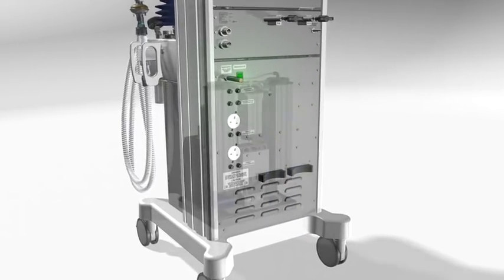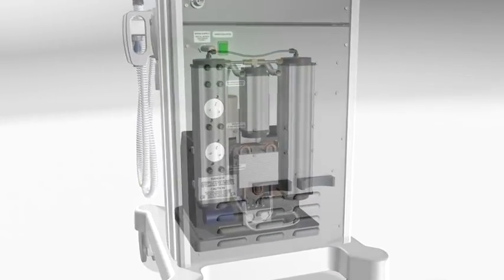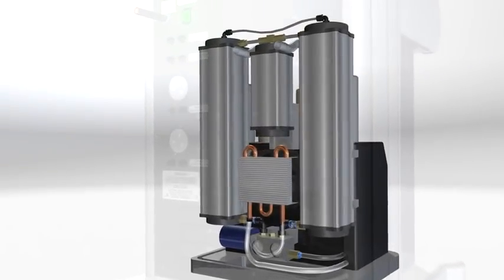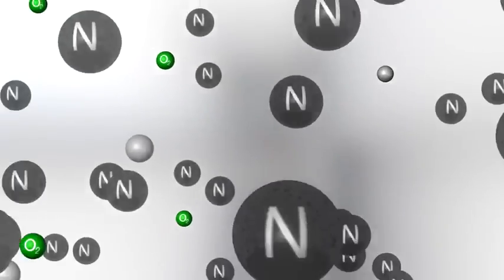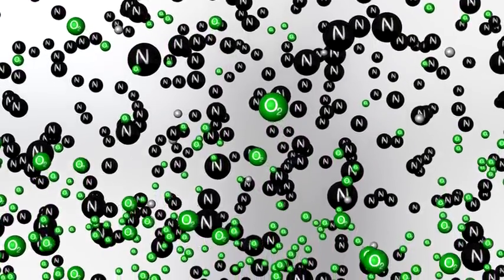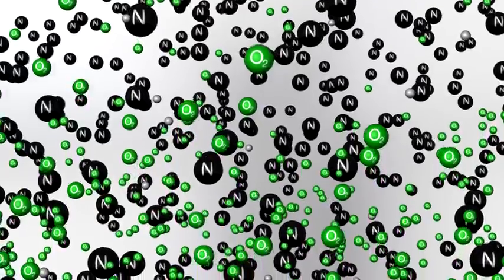Most importantly, the machine produces its own oxygen using an integrated concentrator that enriches room air. Ambient air is made up of 78% nitrogen, 21% oxygen and 1% other gases.